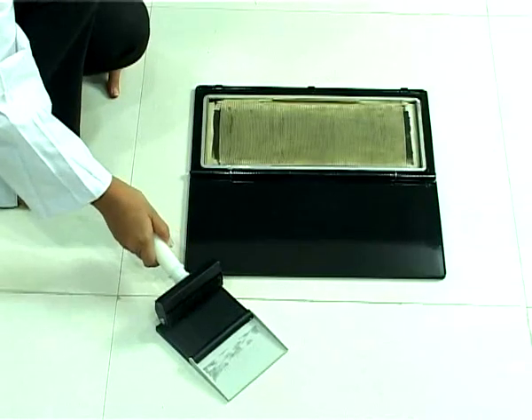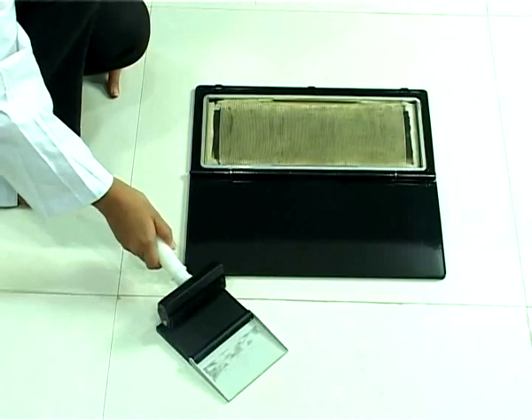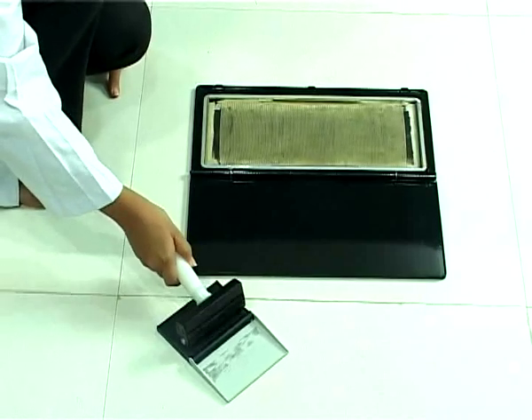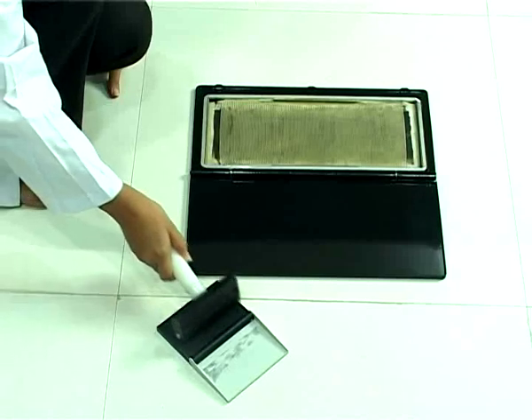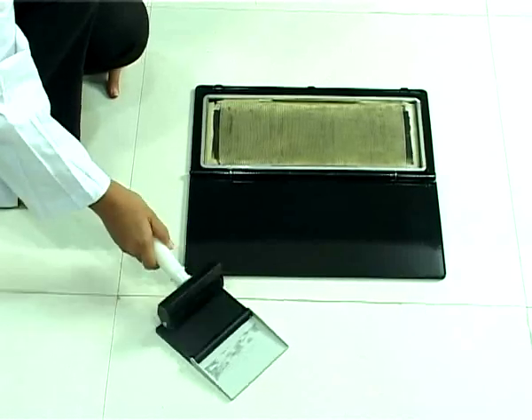Roll the roller on the ink pad till the ink is applied evenly to the roller. Please note, the ink used is regular stamp pad ink but should not have more alcohol content.